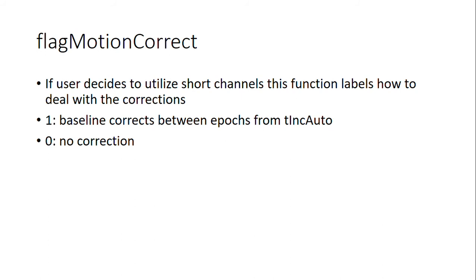So it may not be something you're too concerned with. Aside from that, though, I could also baseline correct it with epochs or between epochs. If I mark it as a motion artifact, you're essentially averaging out those around it as a baseline. So you're removing, say, 2 or 3 seconds of data, and you just put a flat line between it.